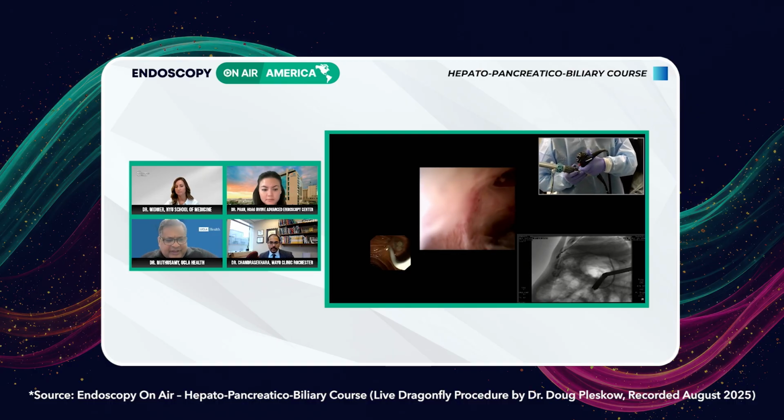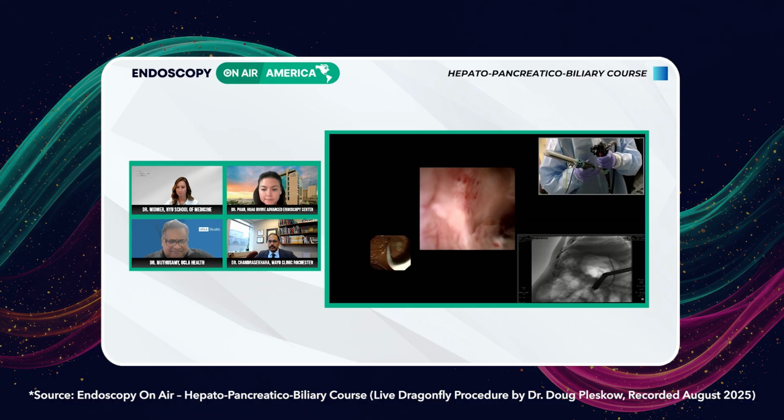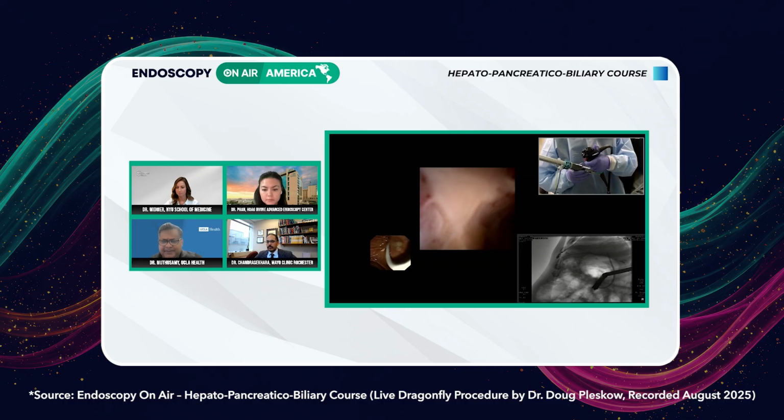Hi, Doug. It's Raman. I know it's kind of early in your experience, but do you see any advantages here? Obviously, it's a nice demonstration of great images in terms of operation, in terms of maneuverability, or what are your thoughts on this sort of new device? Yeah, so great question. I think that the soft tip is really nice. So you can use it if you don't like to use a wire. I think this is very helpful in getting up into the duct. I think the visualization here is really good as well.